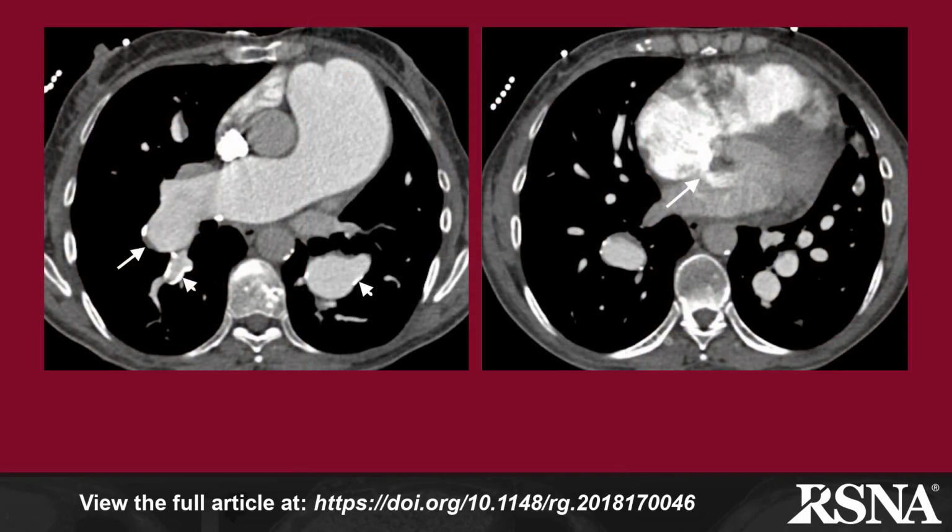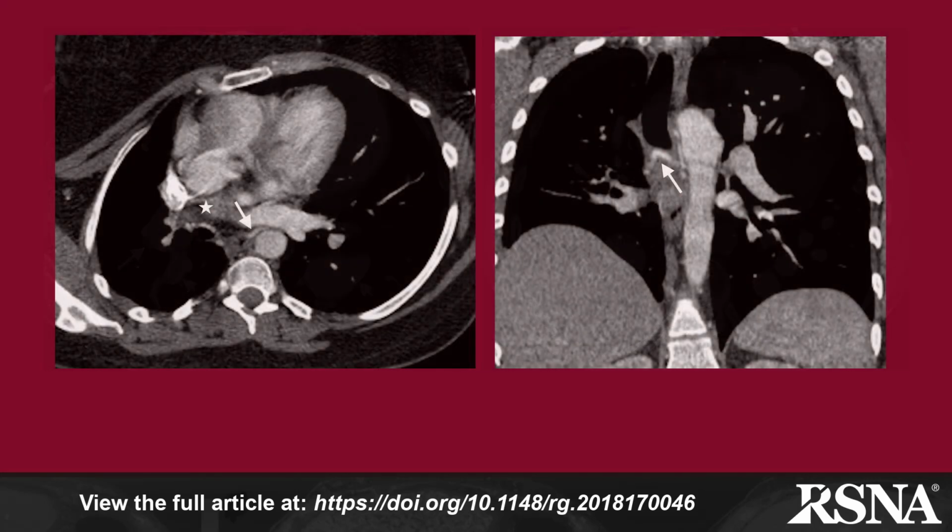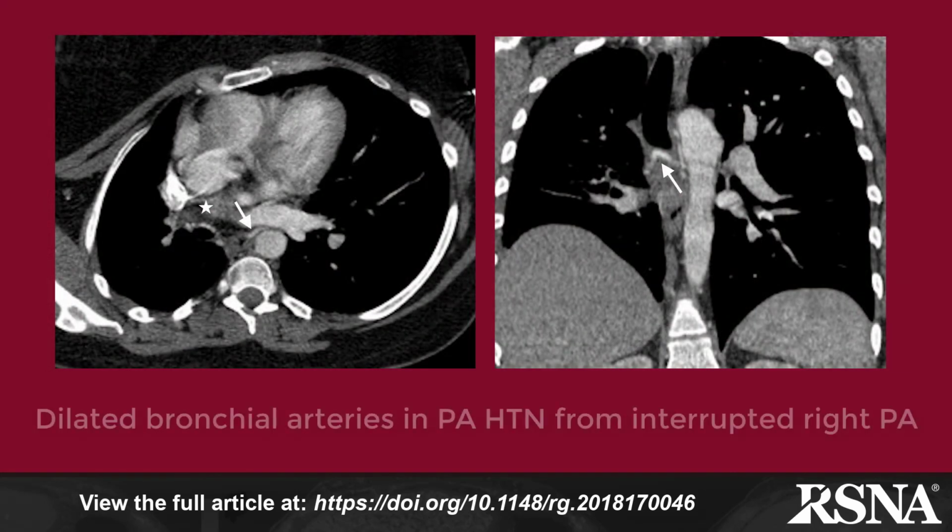Cardiac findings, including left to right shunts, are seen in congenital heart disease, and there may also be signs of left ventricular failure as the etiology of the pulmonary hypertension. Mediastinal findings, particularly the presence or absence of bronchial arterial collaterals, help in the diagnosis of CTEPH, which in contrast to idiopathic pulmonary hypertension is typically associated with bronchial arterial hypertrophy.